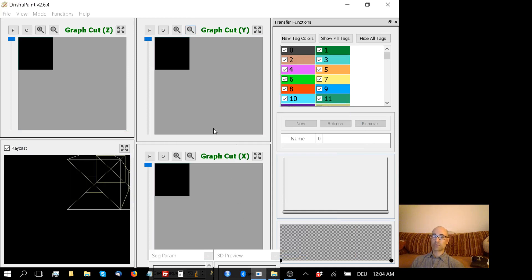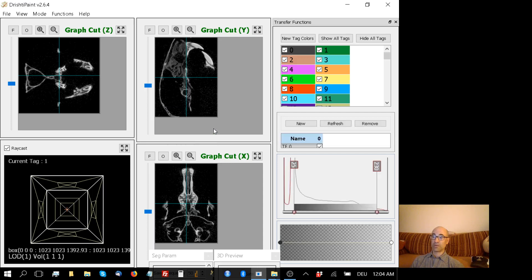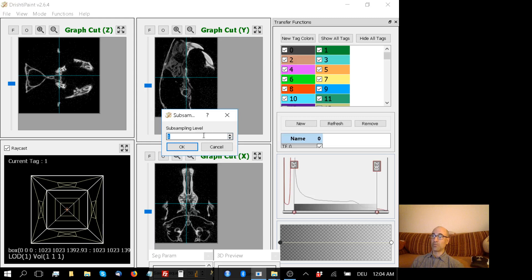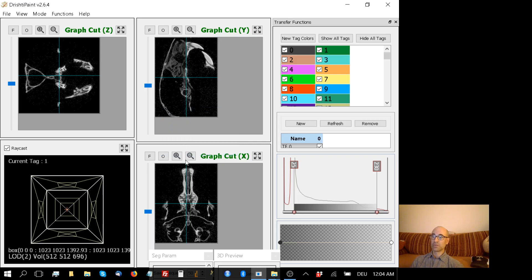It will also ask me if I want to subsample my volume, and that can be very handy when we don't have copious amounts of RAM. My 2GB video RAM is fine, but not unlimited. So I am going to subsample just to 2.